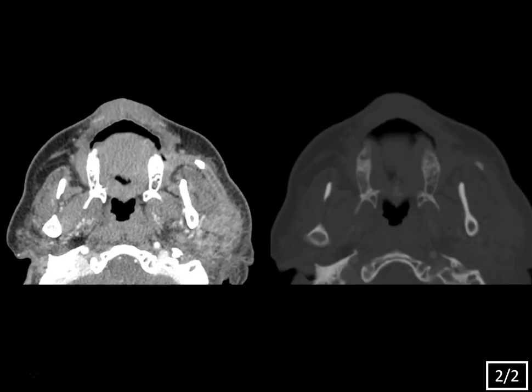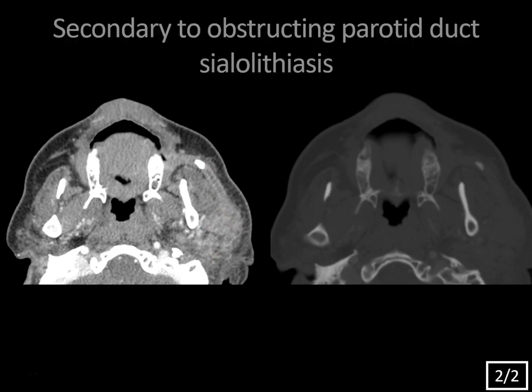These cone-down images show that, indeed, there is a stone here within the parotid duct, also known as Stenson's duct. And upstream of that stone, you see a fluid-filled dilated duct with thickened, inflamed walls, leading to that inflamed parotid gland. So this is left parotid sialadenitis secondary to an obstructing parotid duct stone, or sialolithiasis.